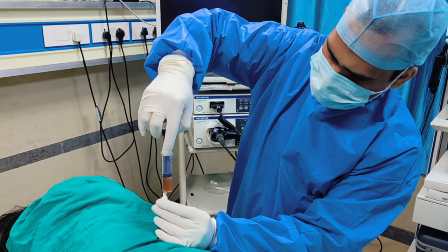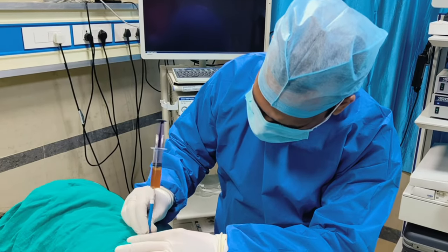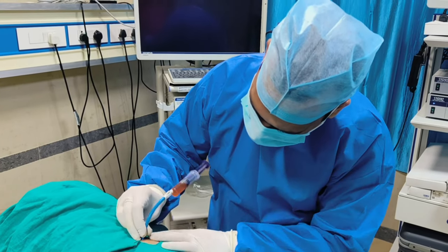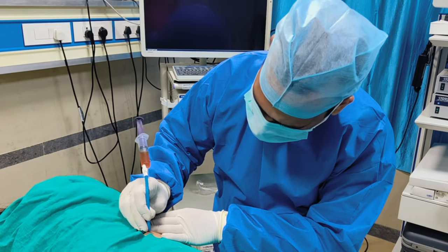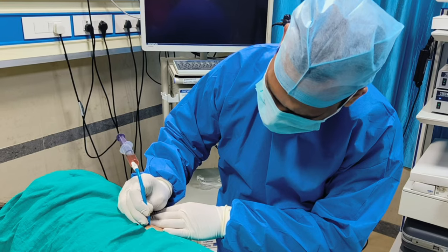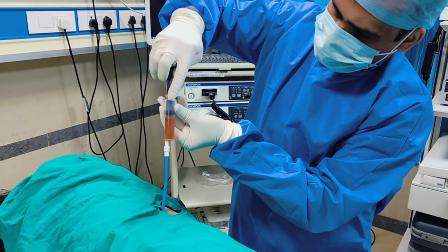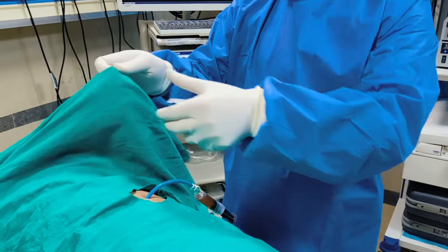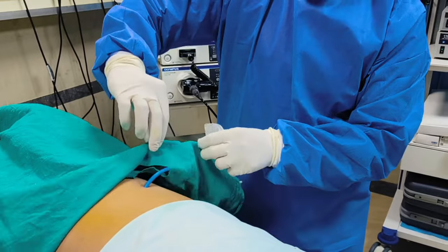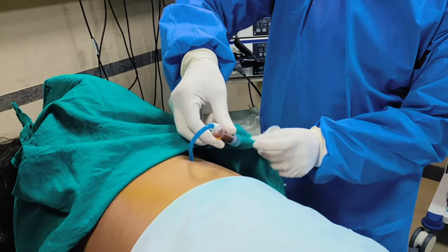We confirm free fluid is coming. Now we will withdraw slightly until there is resistance — resistance means the tip of the pigtail is approximating against the ribs. We will then insert one centimeter back inside and check again. Free fluid is confirmed. This is our pigtail catheter in the correct position. Now we will remove the cut sheet for dressing.